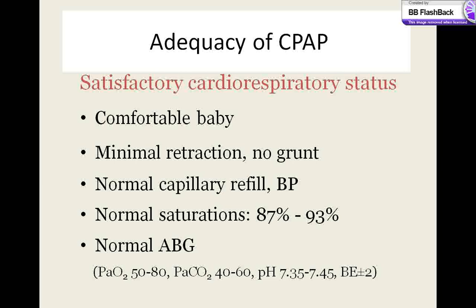A pink, well-perfused baby with SpO2 in the range of 87 to 93% and PO2 between 50 to 80 mm of mercury confirms adequacy of CPAP.